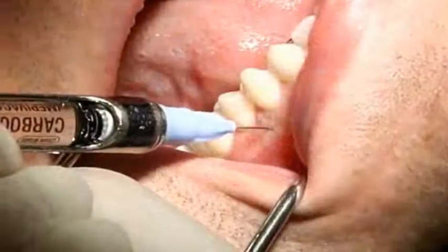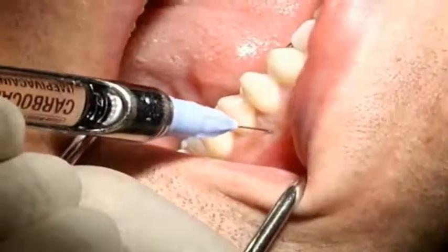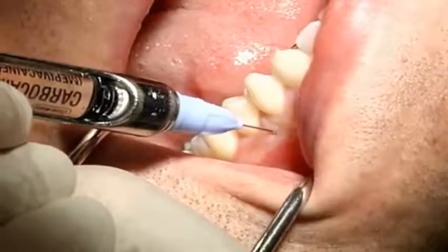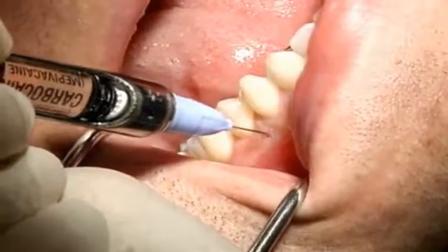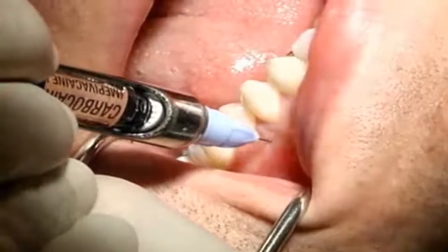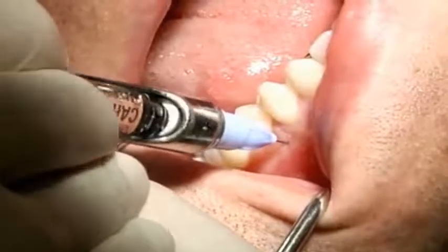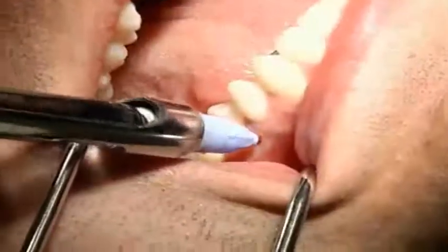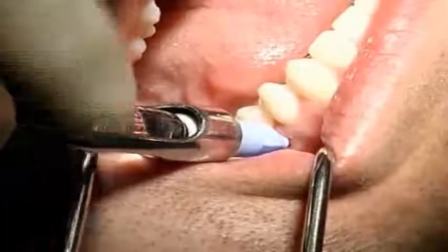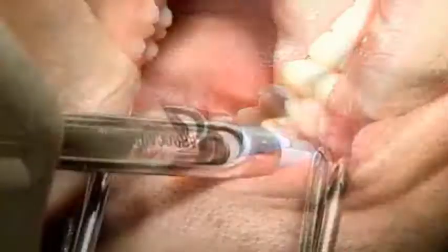The needle must be positioned exactly in the same spot and in the same orientation as the perforator. Otherwise, it will not penetrate and be in proper position. Some maneuvering is often required. Place the needle to its hub against the tissues to minimize leakage of anesthetic into the oral cavity.